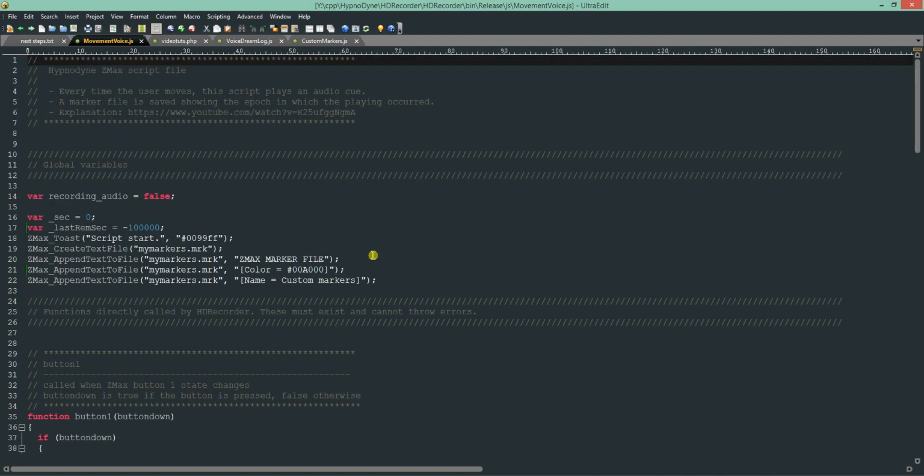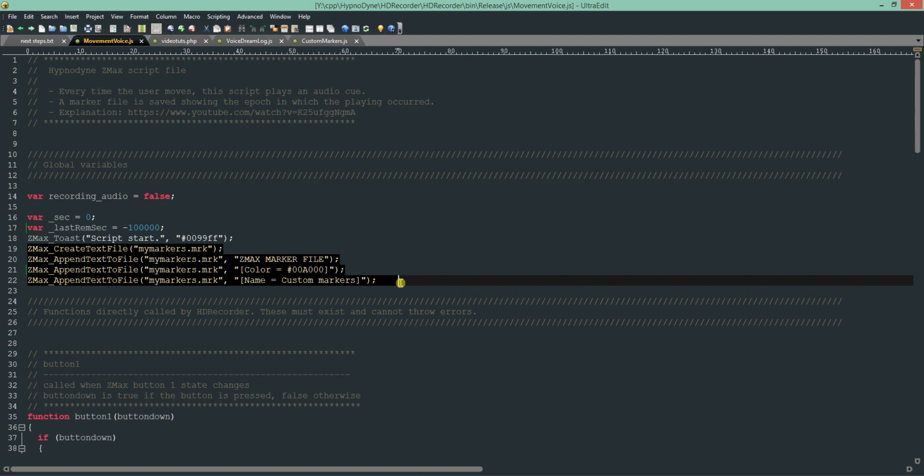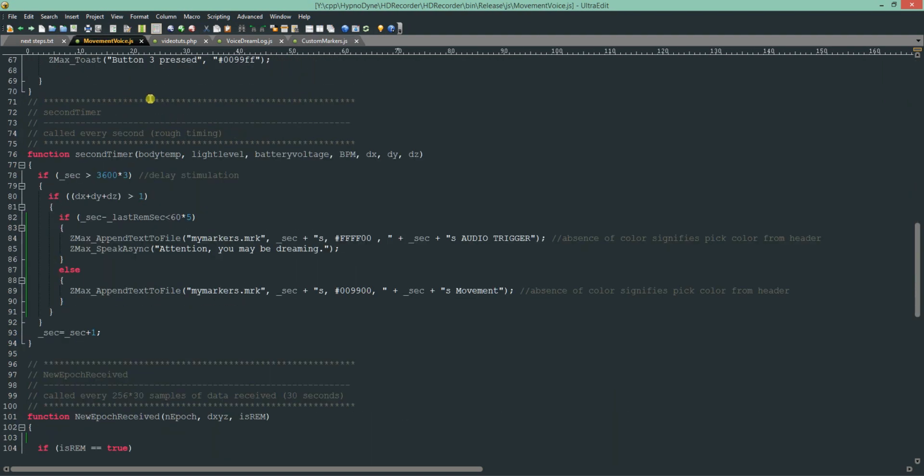Now, to do this, it was really easy. I just defined two counters for what second we're at. This is just a number that increases as the seconds pass. And this is the last REM second, so I'm keeping track of how many seconds passed since the last REM epoch detection. This is nothing, it's just to show that the script has started. I create the text file with its header. This is copied verbatim from the custom markers example. So it's just something you would cut and paste. The rest, I didn't change anything in the buttons.